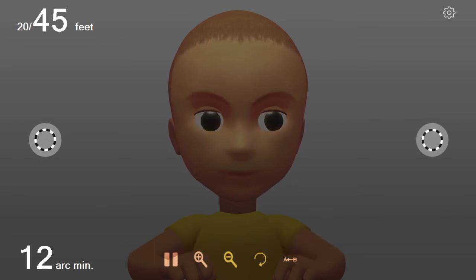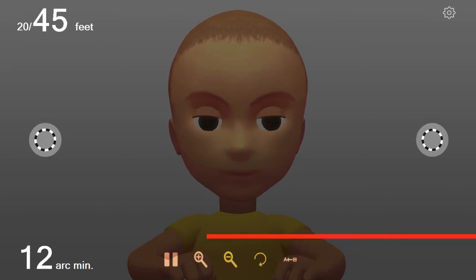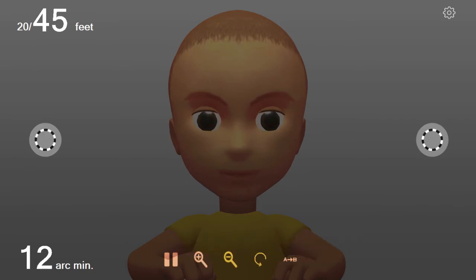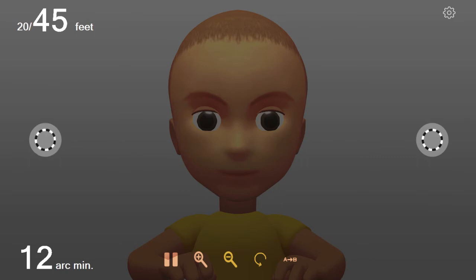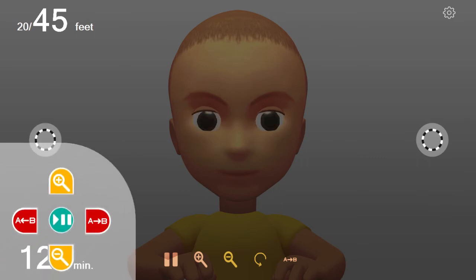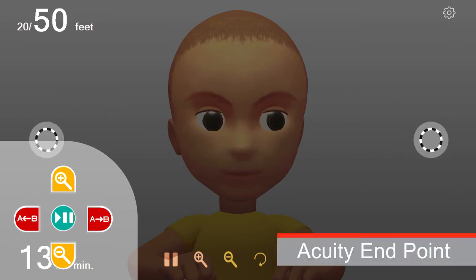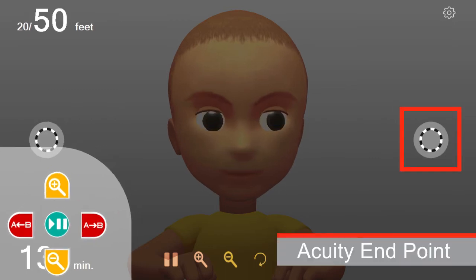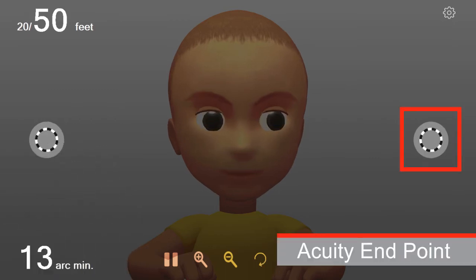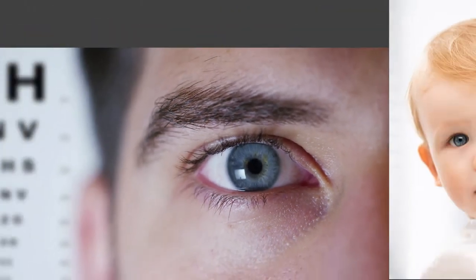A verbal child might typically blurt, "it's disappeared." When that DIOP rotation has disappeared, make the DIOPs slightly larger until the child is again able to track the location of that rotating DIOP. That smallest DIOP where motion tracking is detected is the acuity endpoint.